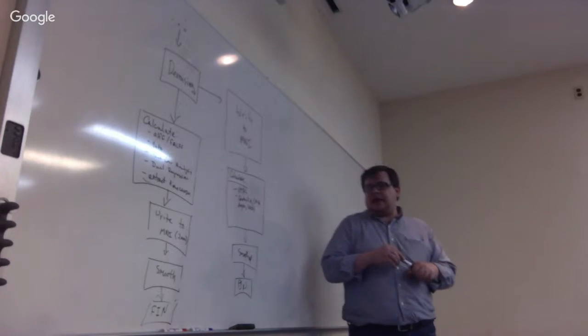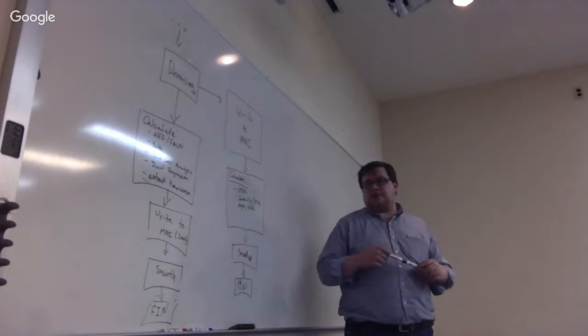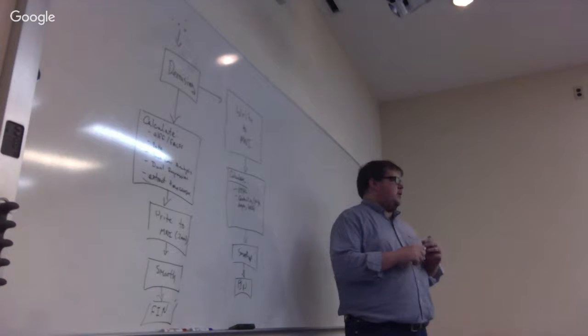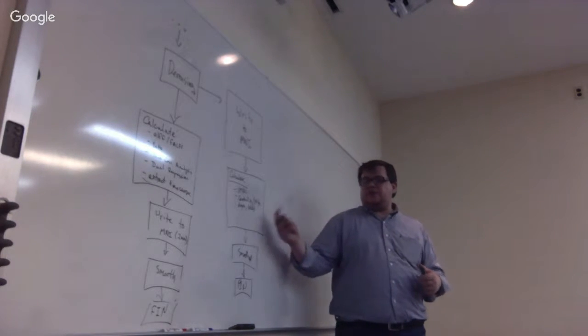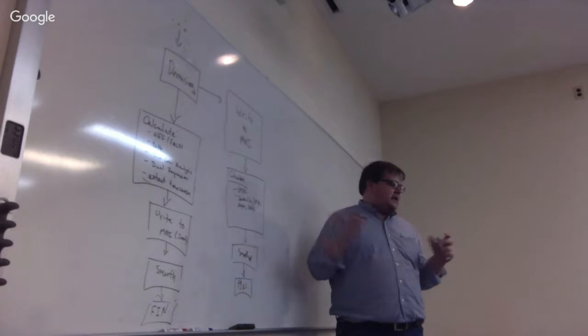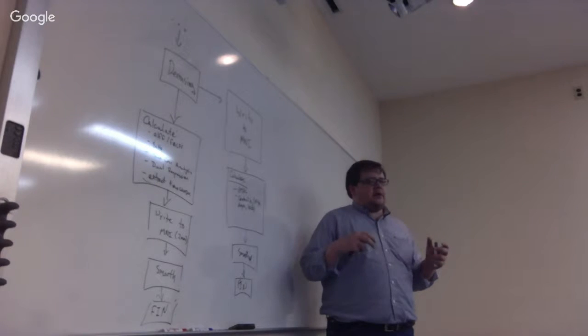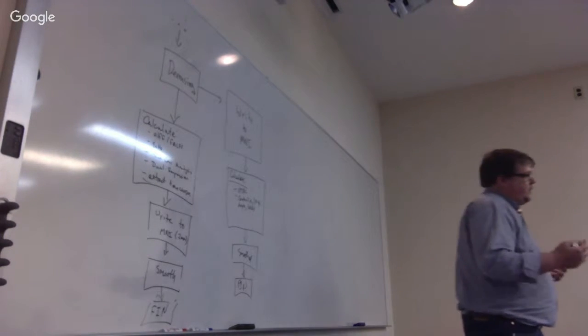So another thing about centrality is we've been working a lot on this, Danny and I, in terms of optimizing it. But this was the other area where it could really blow up on you in terms of both memory and speed. So when you do centrality, you want to limit yourself to just the gray matter because it makes a lot more sense to only look at the connections between gray matter.